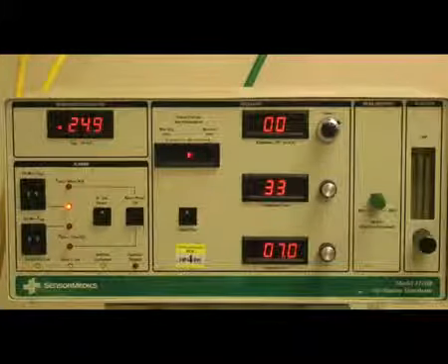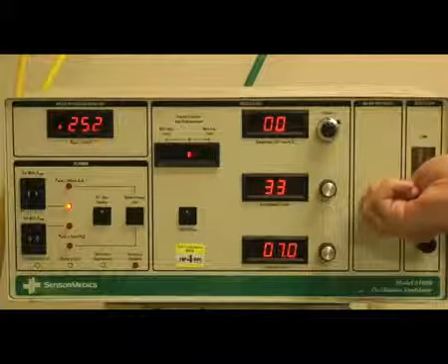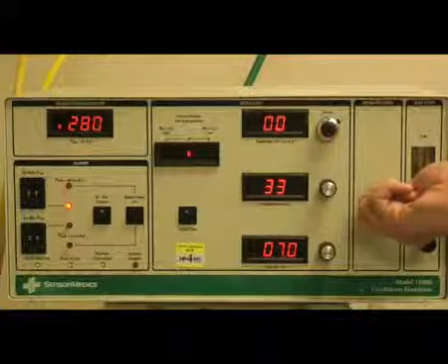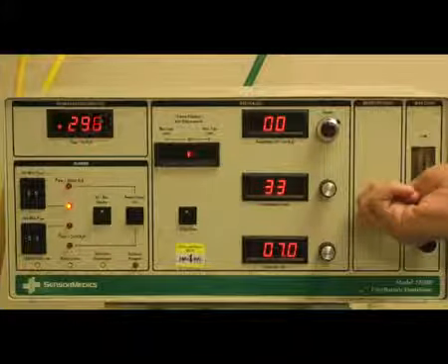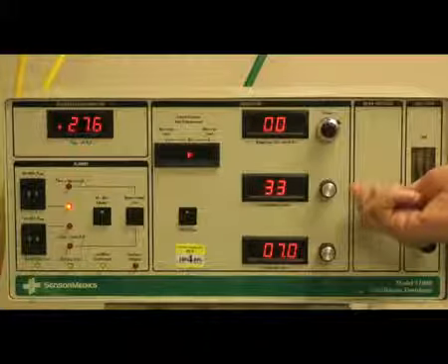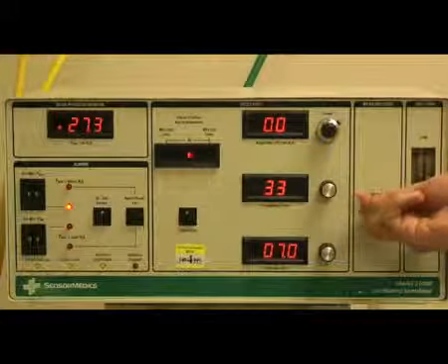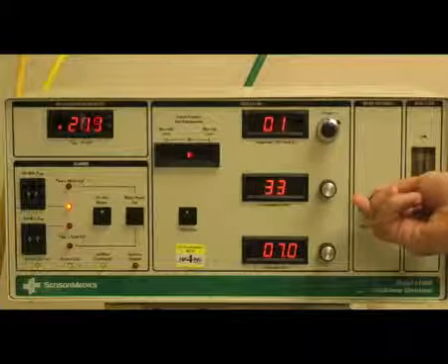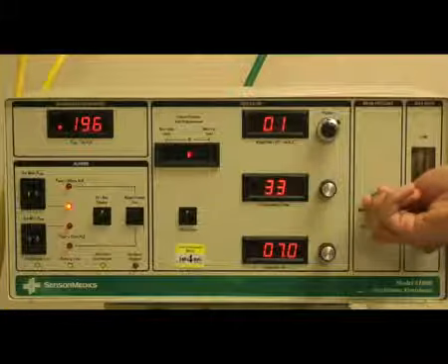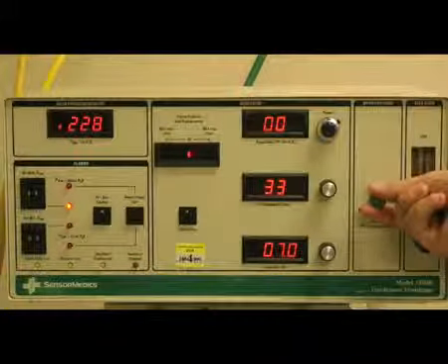As you perform your recruitment maneuver, you will turn the knob clockwise to increase your mean airway pressure, and then counterclockwise to decrease it. It is always important to remember that adjusting this knob should be done in slight increments, as extreme changes in the knob position can cause extreme changes in your mean airway pressure, which could result in a loss of recruitment on a patient.